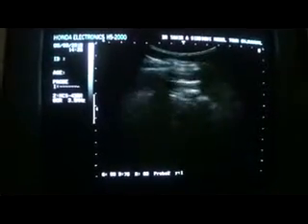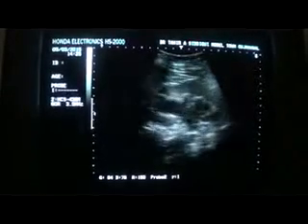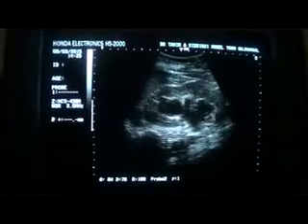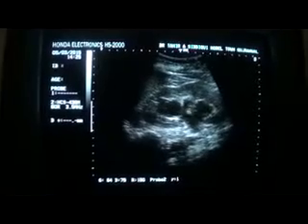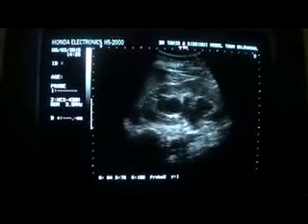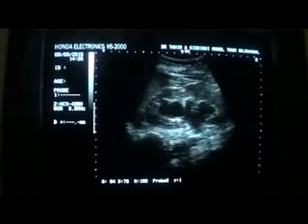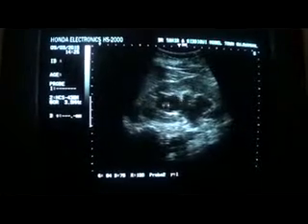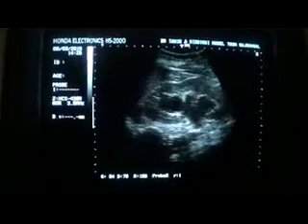This is the left kidney. The upper pole is in front of you. This is the upper pole, mid region, the lower pole. Now you see that there is dilation of all the calyces, upper, mid and lower. And this is the parenchyma, normal parenchymal echogenicity. Thickness is normal. These are the medulla. Corticomedullary differentiation is intact. No calculus seen within the dilated calyces.